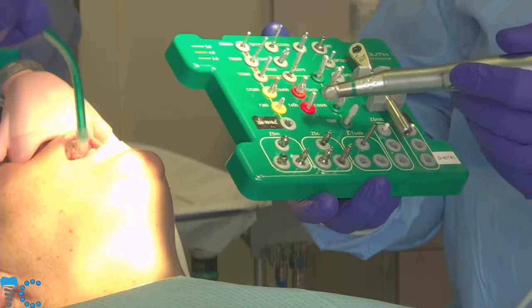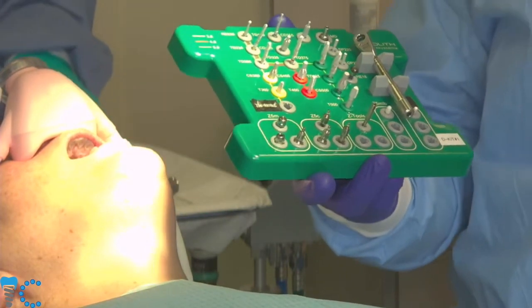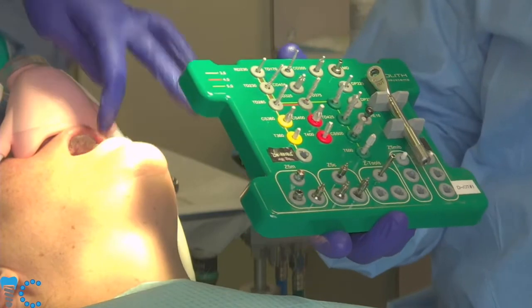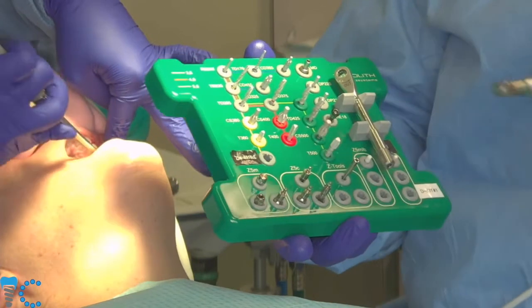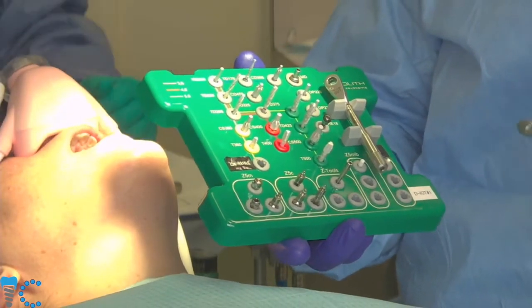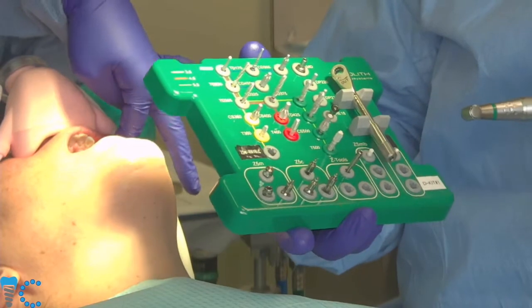shoulder. And then we have the tap. And the 4 millimeter tap is, a lot of implant surgeons aren't used to seeing the tap. When implants were mostly cylindrical or parallel walled implants, almost all systems had taps. Now, many of the implants are designed to be self-drilling and self-tapping, so you don't see the tap in a lot of systems. But with the parallel walled systems that don't have self-threading, self-cutting implants, then we do need this tap. So regardless of the bone type, we generally will use the tap.